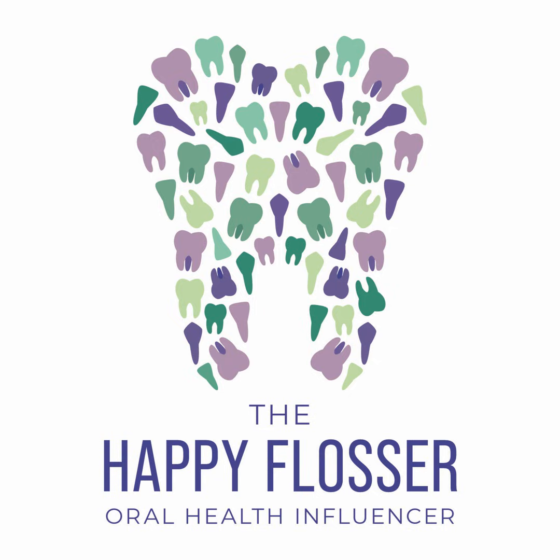We're looking at that cortical bone, the outer surface of the bone that's closely packed together, right? This is very dense on the mandible, so it will look different than on the maxilla. And the cortical bone is used to evaluate that interdental alveolar crest. And we know that in health, that appears as a thin, white line called the lamina dura. Now, the cancellous bone is less radiopaque than the cortical bone. It's lace-like in appearance, and that fills the interior portion of the alveolar process.